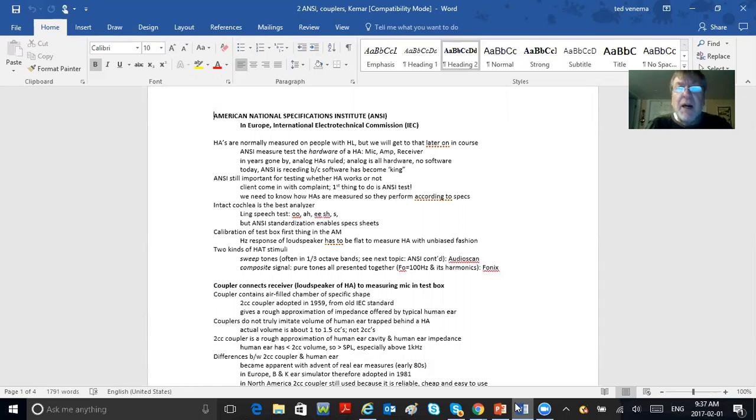In years gone by, analog hearing aids ruled. Analog is all hardware, no software. Okay, analog was the prior type of hearing aids before digital. Analog ruled until 1997, and then digital took over big time. In 1997 was the emergence of the first digital hearing aids. So digital has been around now for some 20 years. But hearing aids were all analog before that.